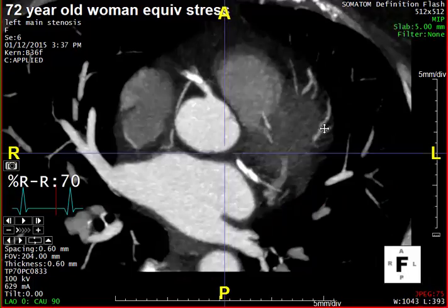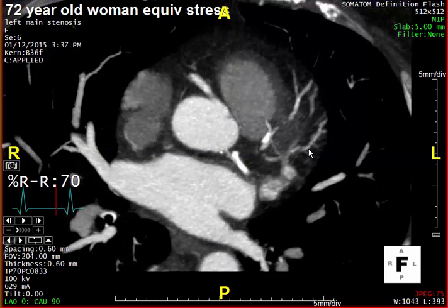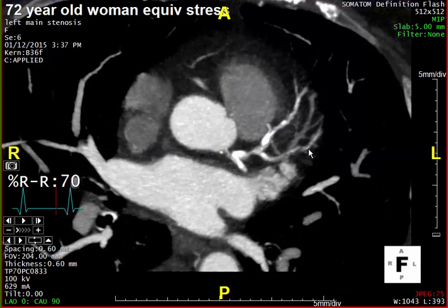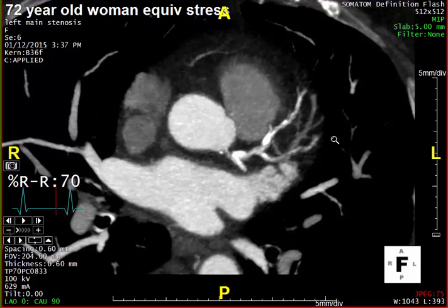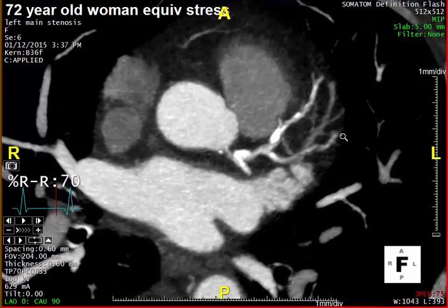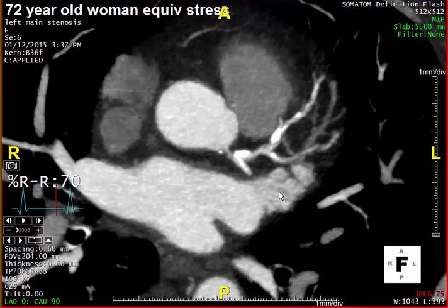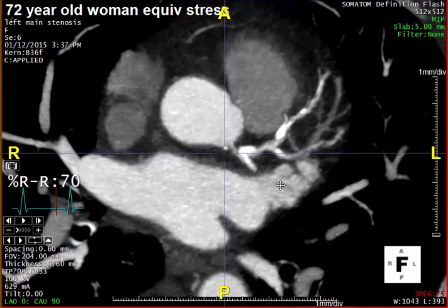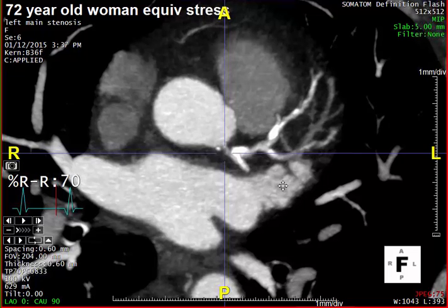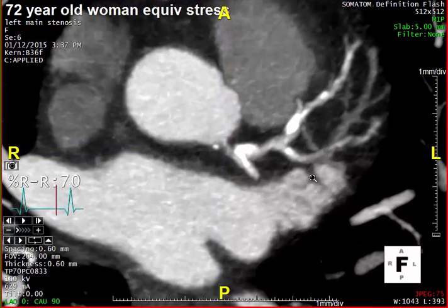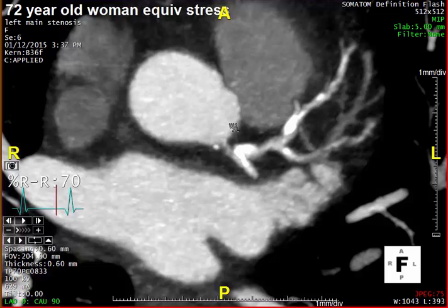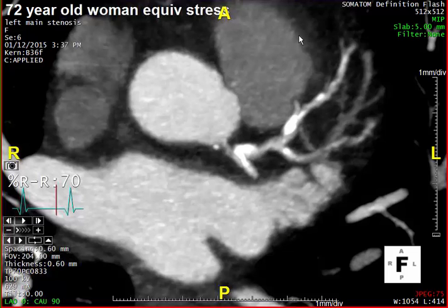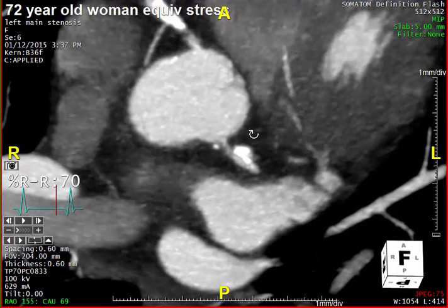Now, if we look at the two-dimensional maximum intensity projection, we are struck with one initial observation. You should begin at the left main, and when you look here at the left main, you can see that there appears to be a distinct narrowing with some calcified and possibly layered non-calcified plaque in the same distribution at the ostium of the left main coronary artery.